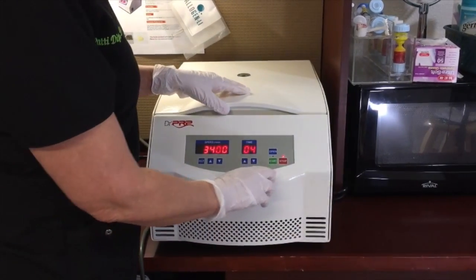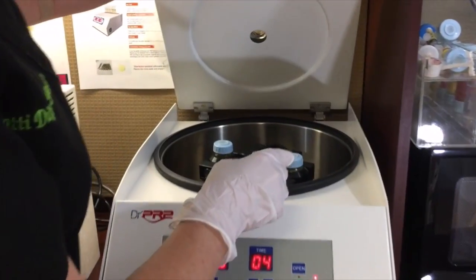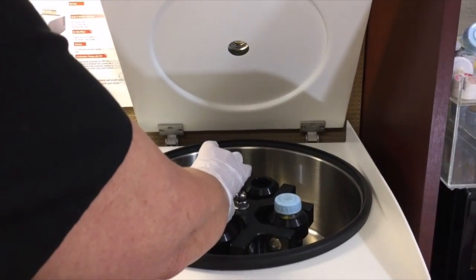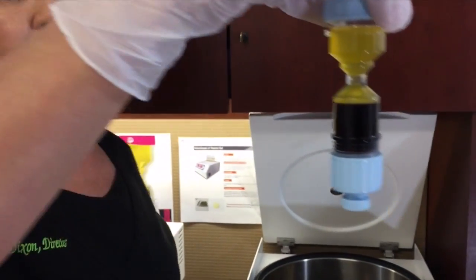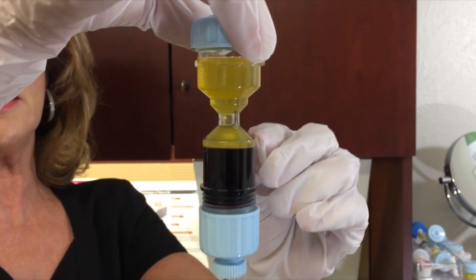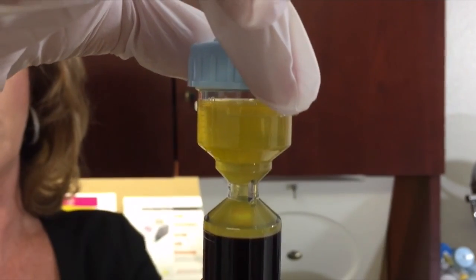Now that the centrifuge has stopped, let's see what we've got. This is a perfect separation. What you want is anything right at this ridge or slightly below.